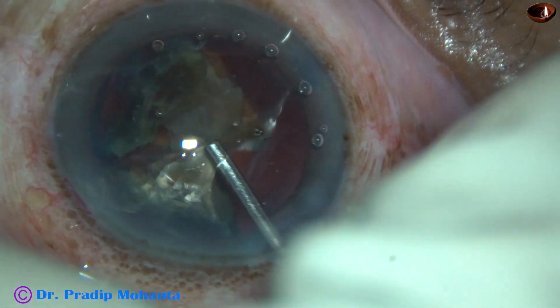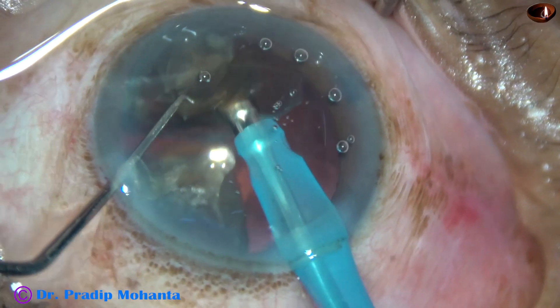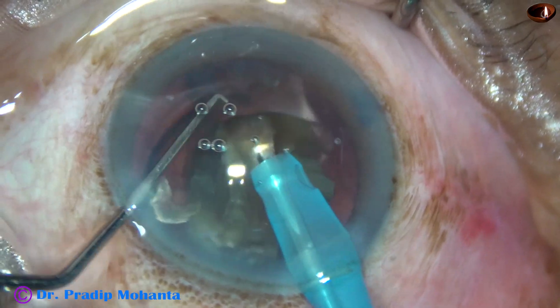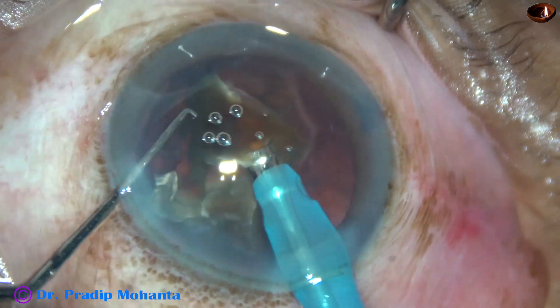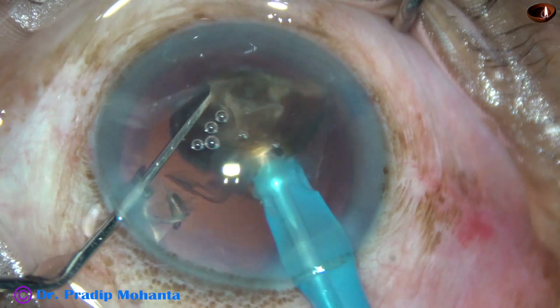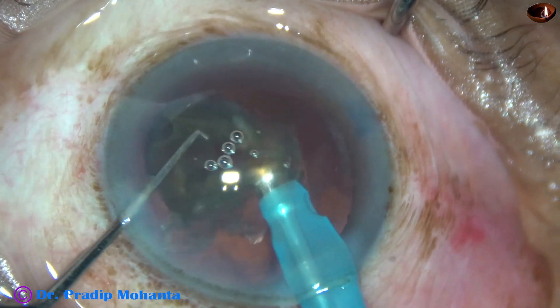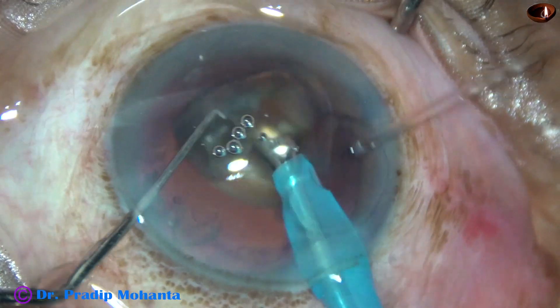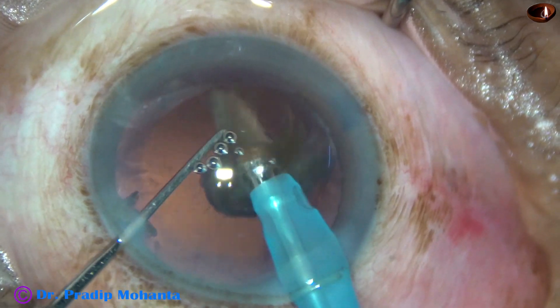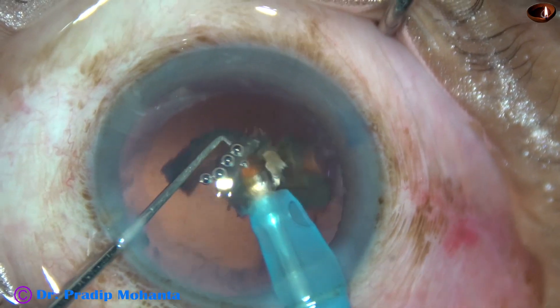After emulsifying half of the nucleus, I come out and refill the entire chamber with 2% HPMC (hydroxypropylmethylcellulose), then go in again and emulsify the last two pieces. This is the strategy in hard cataracts: come out after emulsifying half, refill the anterior chamber with HPMC, and then complete the case.